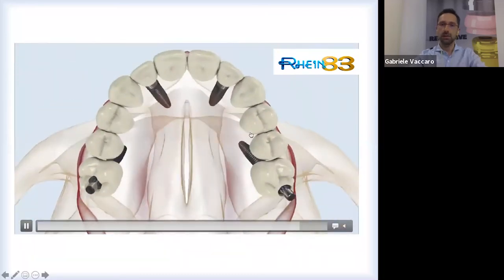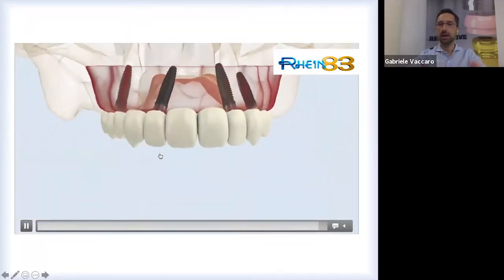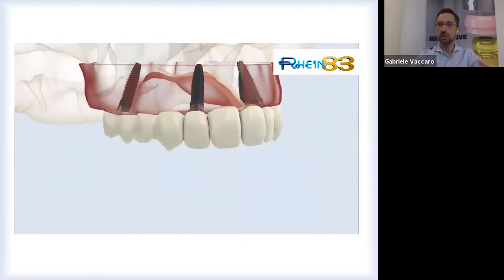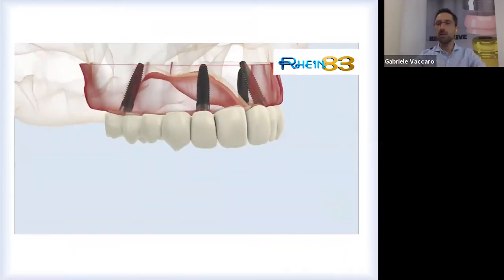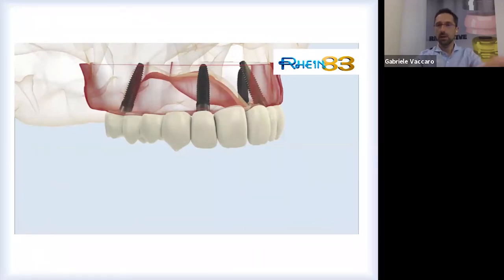As you can see, in this kind of framework, you don't have the passing through screw. So you have just two screws. And these two screws are not working as a mechanical retention, because the retention is given by the Seeger ring. The main work of these screws is just to fix all the pieces together. And this is very important, because since you are changing the mechanical stress that loads the screw, screw loosening and screw fracture become a very, very rare event.